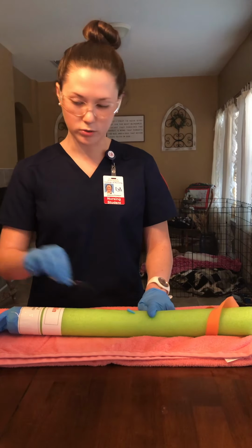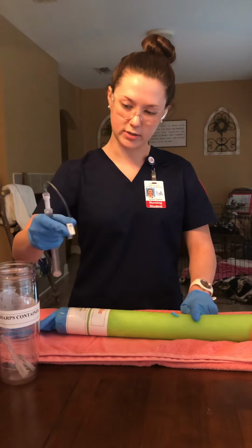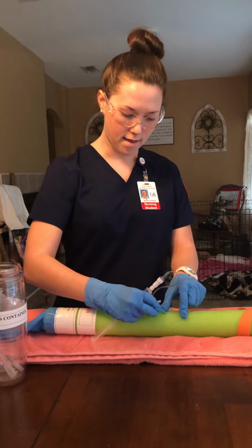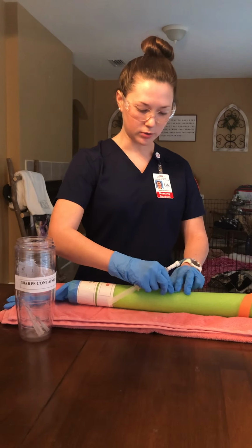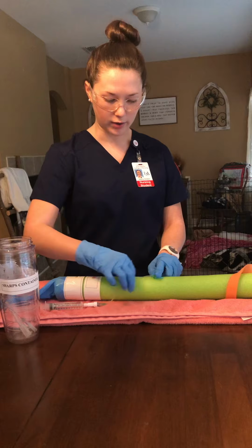So once I do that, I'm going to remove the needle. I'm going to quickly get this while maintaining sterility. I'm going to open it up and connect it quickly. So once it is connected, I'm going to try not to move it around so much, but I'm going to temporarily secure with tape.